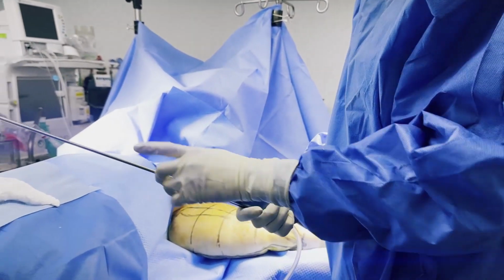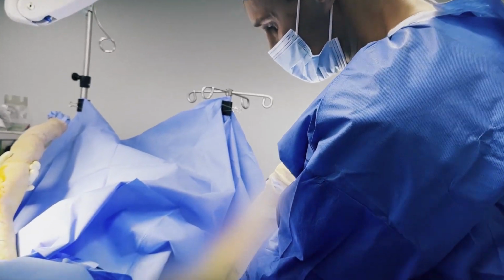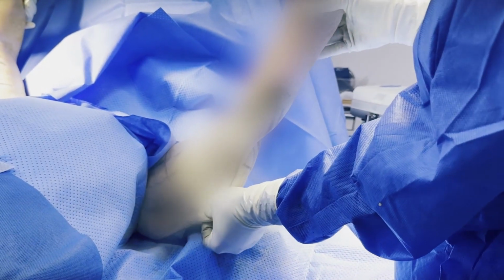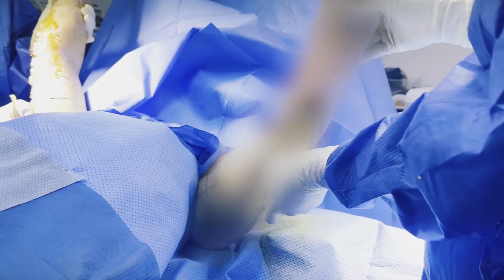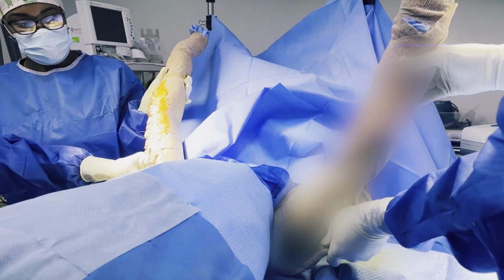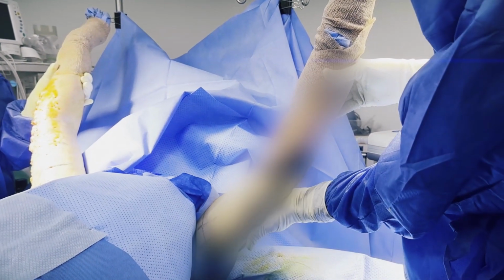So again, we start with the power-assisted liposuction to remove the extra fat prior to skin excision. We're done with the fat removal again on this side. See how all that unsightly loose skin is going to come out. It's going to look like that. If you take a look at the other side, we're closing the other side right now, and it already looks way better than this. So we just got to get rid of that extra skin, just like that.